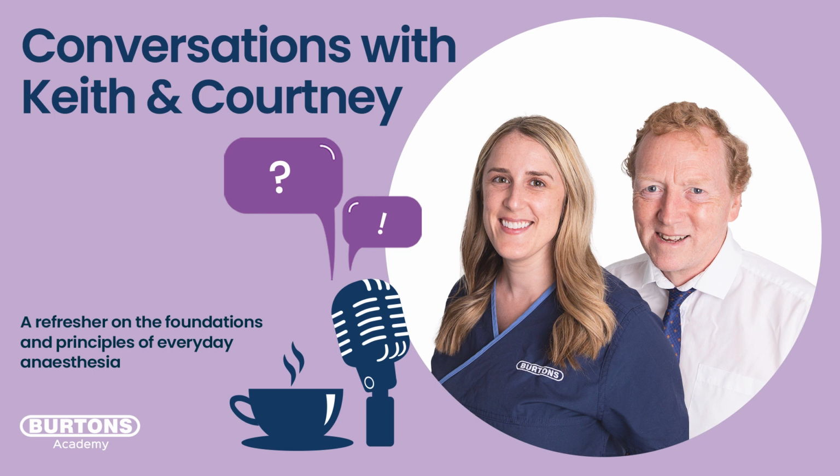And then the how much has to tie in with, if I put this in, and as we said earlier, this is going to create positive pressure. How much pressure? I think this is what worries people. Because you can't look at an animal and do a little calculation. You can't weigh it. You can't measure it. You can't take its surface area or its total body volume. You can't do anything and say with accuracy, the pressure that I need to ventilate the animal is this, based on some parameter that you can measure.